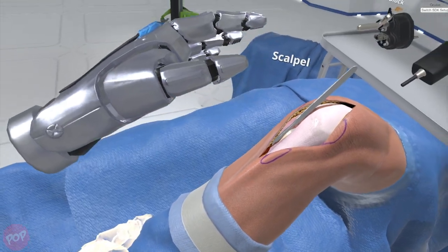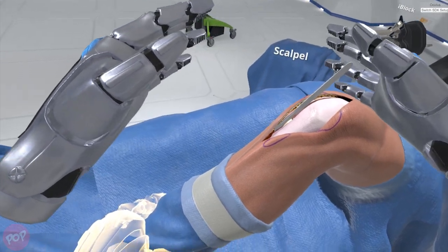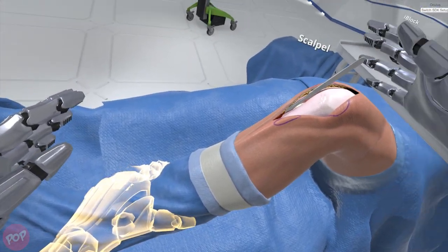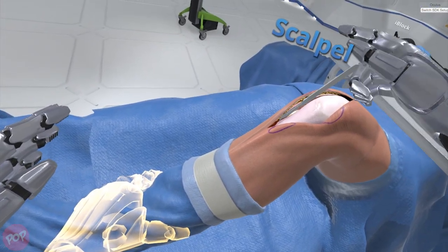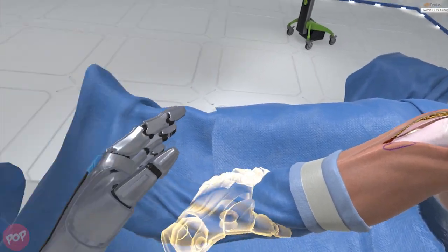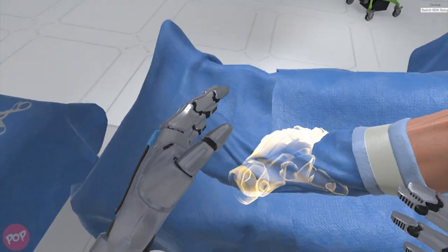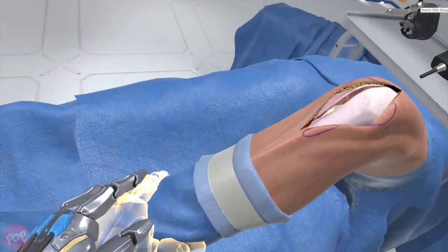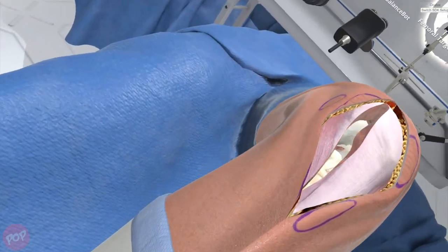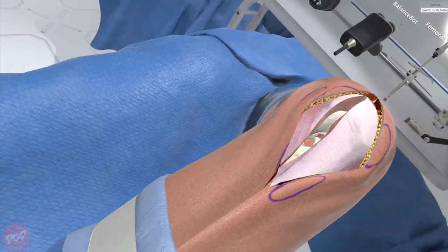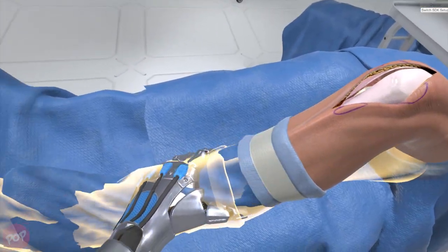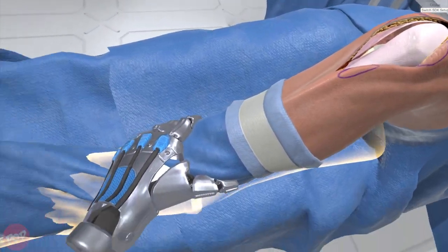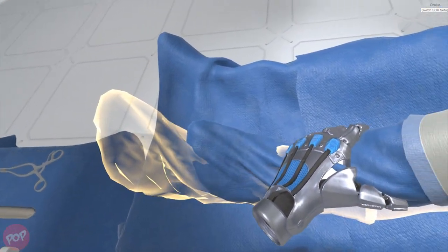Grasp the patient's left ankle, preferably with your left hand. Now move the ankle to position the knee into full extension.